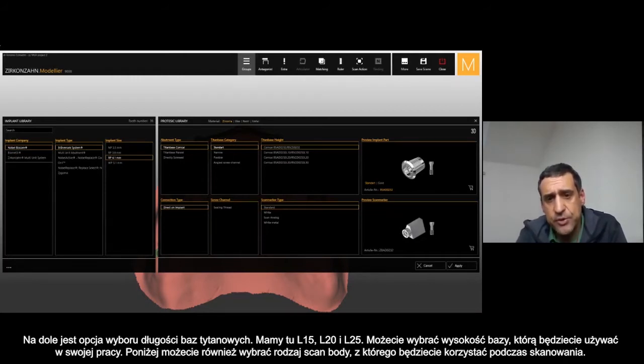On the bottom you have the option to choose between different heights of the T-base. You can see that we have L15, L20, and L25 here — you can choose the height of the T-base that you want to use.